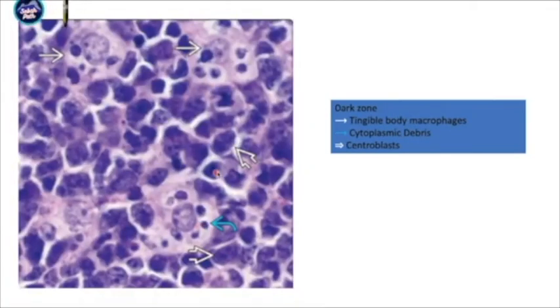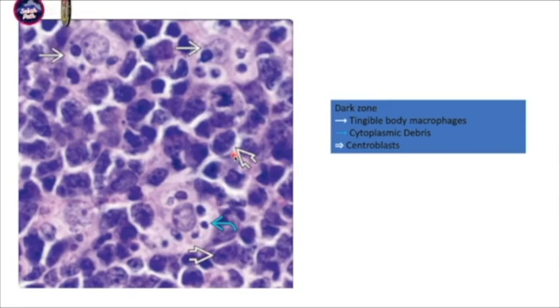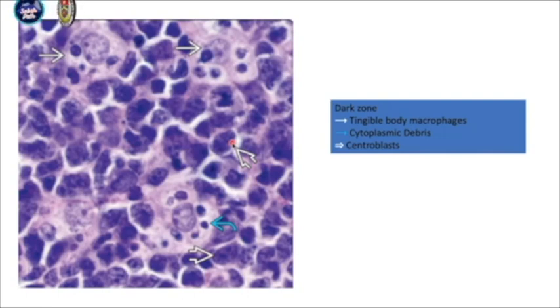If you look at the higher magnification, in the dark zone you have centroblasts — the lymphocyte is a bit larger and you can see there's a nucleolus. For centroblasts, the nucleolus is at the peripheral area. And usually if the nucleolus is in the center, it is called an immunoblast.